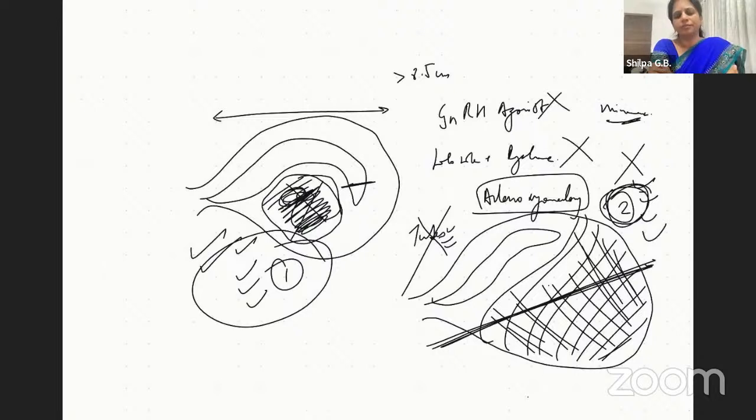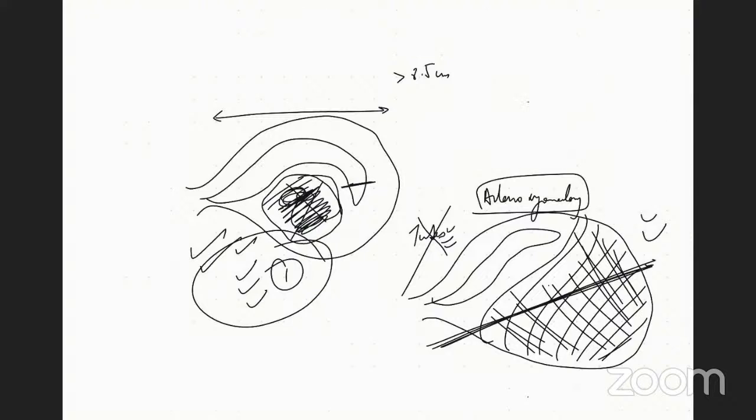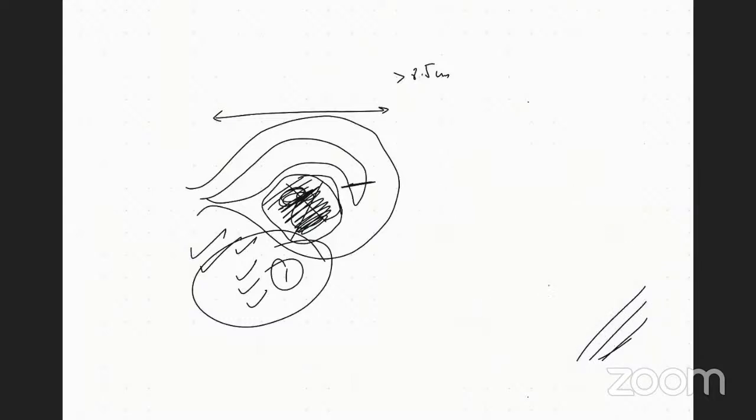But we are now doing ablations for recurrent adenomyosis. As you know, we get a huge volume of patients where one adenomyomectomy has already been done. Primarily when an adenomyoma goes to a consultant, they would want to call somebody, get it done, and at least experiment. Once that experimental window is finished and the adenomyoma has recurred, that is the situation where microwave ablation will be very good. Even if you do a great adenomyomectomy, madam, there will be adhesions, and you first have to go inside and do the complete adhesiolysis, which even the primary surgeon who has operated will not be willing to do, because those are bad adhesions.